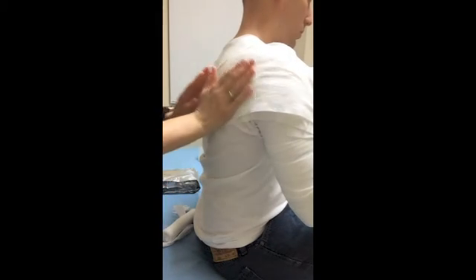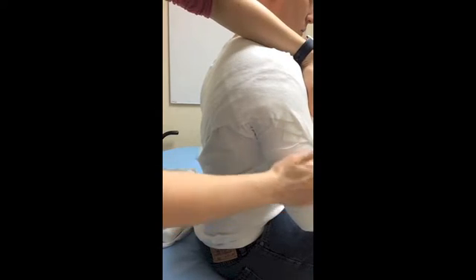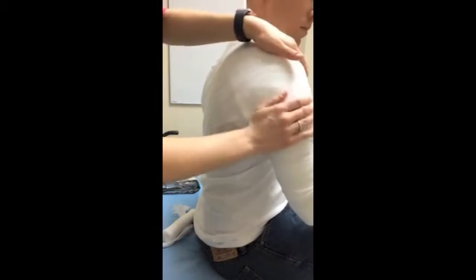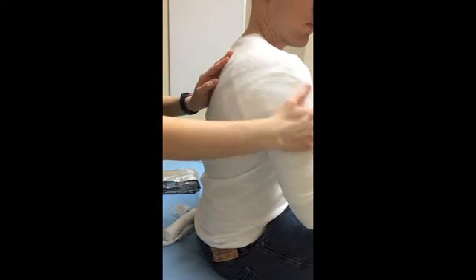And again, this would generally be onto bare skin. So you'll be able to have a little bit more contrast and see what you're doing very well when you have a patient who is wearing a gown where you could slip that arm out.